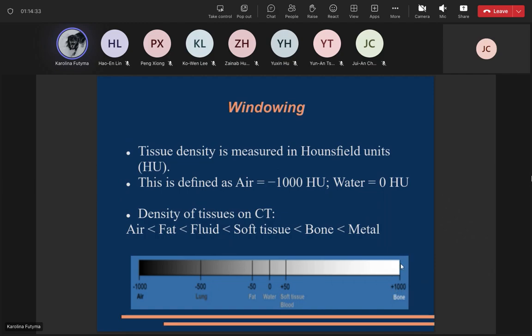So here we have up around 2,000+ Hounsfield units the bony structures, calculus, teeth, of course, and the metal equipment. Around 0, here we have water, and the most black areas are airy areas.